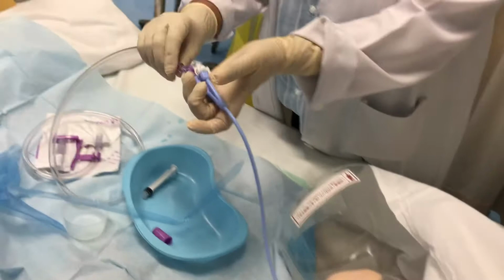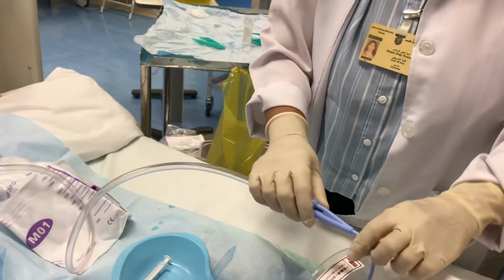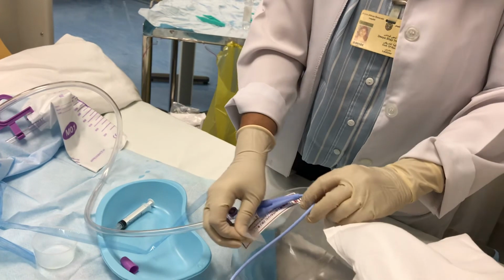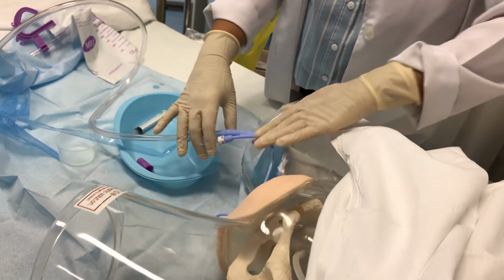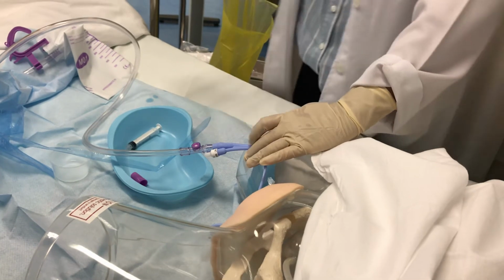And this is very important, explain the purpose of it. Now it will be leaking there. Yes, there is already some urine. So I'm going to use this one here, on this side. Don't make it so tight, so that the patient is comfortable.